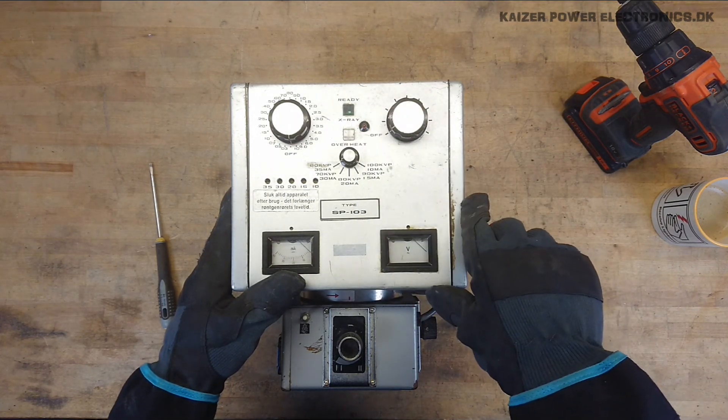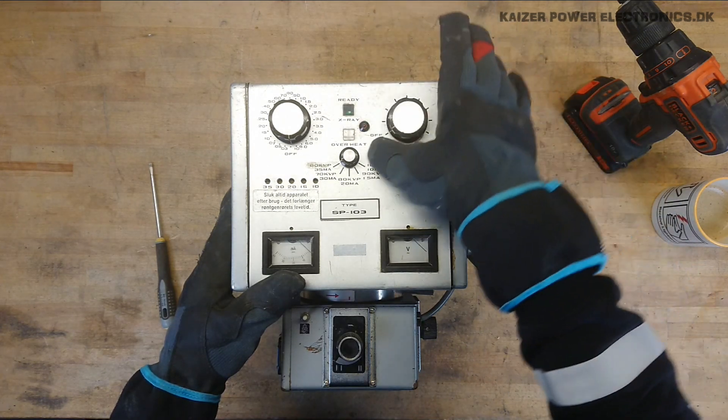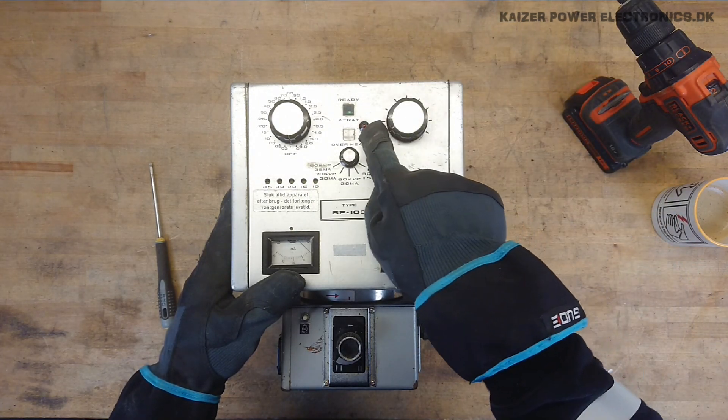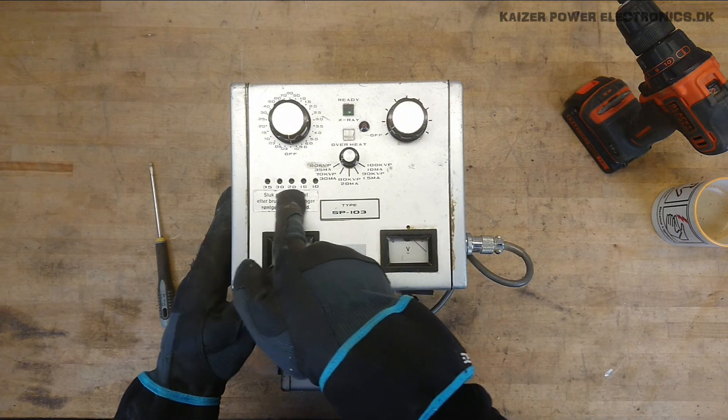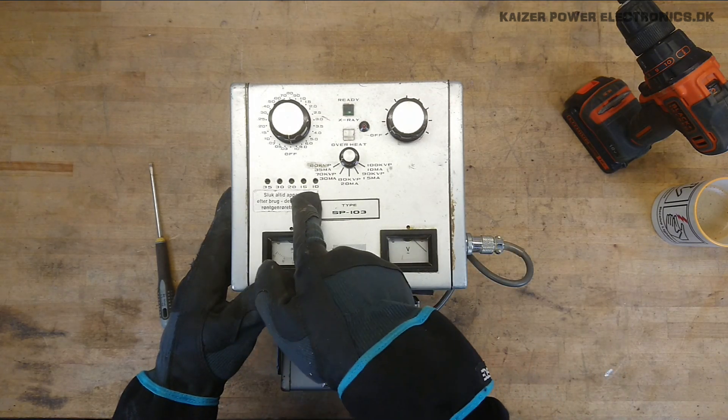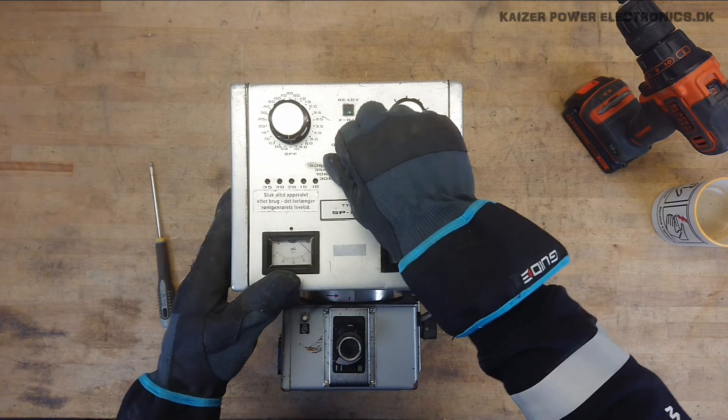Not quite sure what that is — maybe that's just ready. X-Ray and overheat. So the X-Ray lamp has been added later on. It seems we also have some status indicators for the current here, as these numbers correspond to the current settings we see here on the dial.